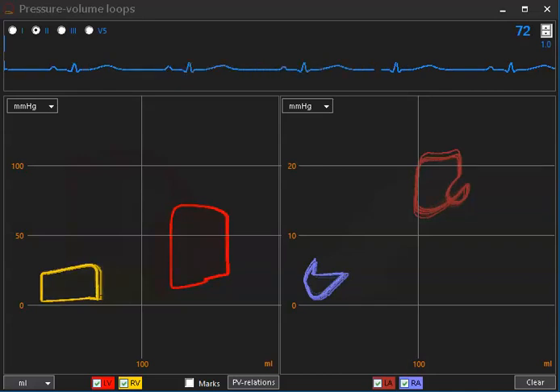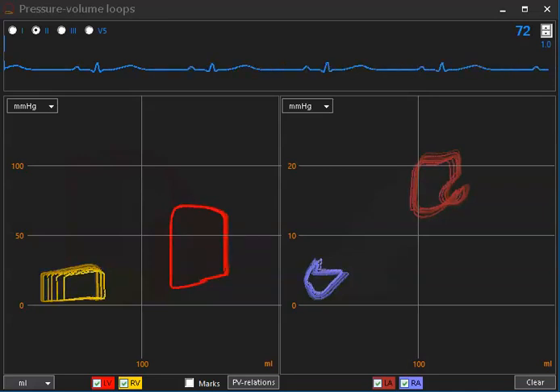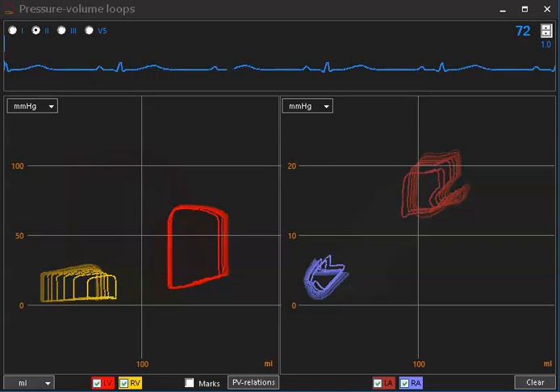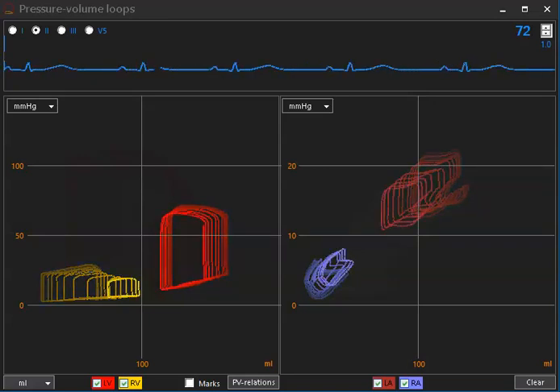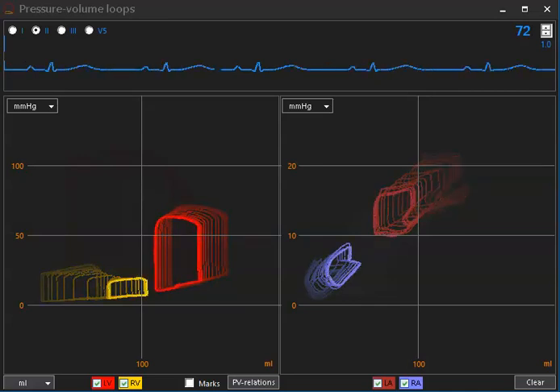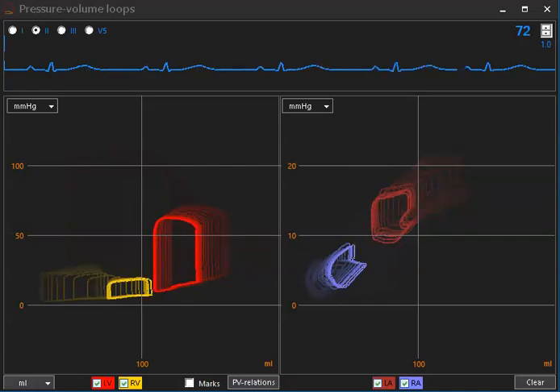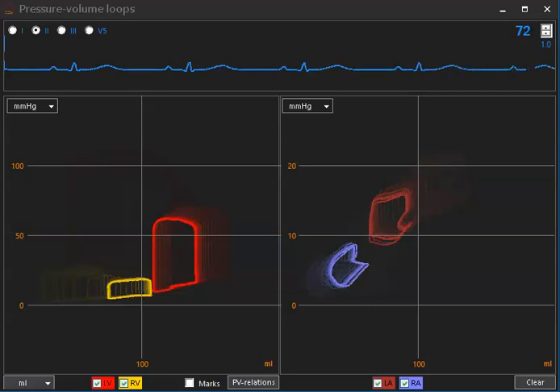You see that also reverts left atrial pressure increase. Just waiting a few seconds for a steady state, and then I'll start veno-arterial ECMO.